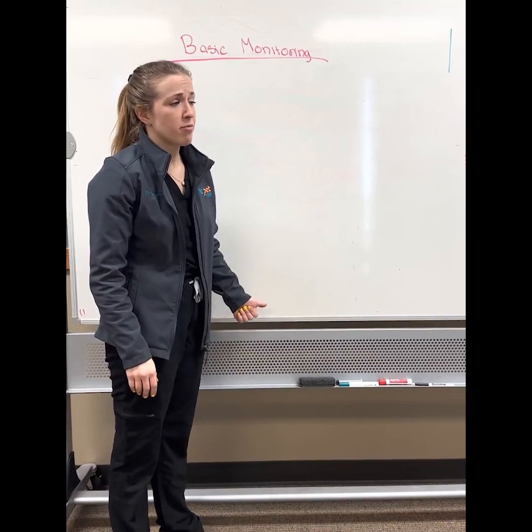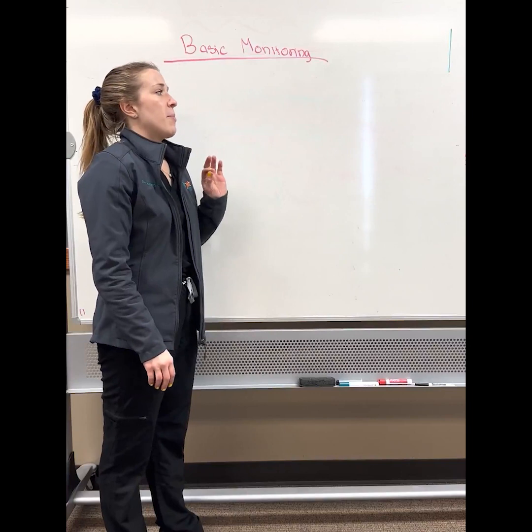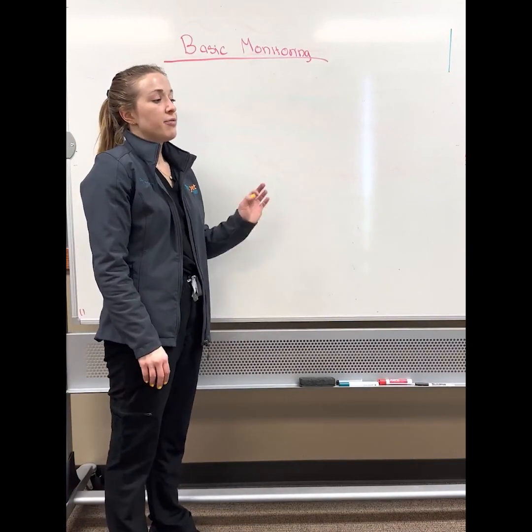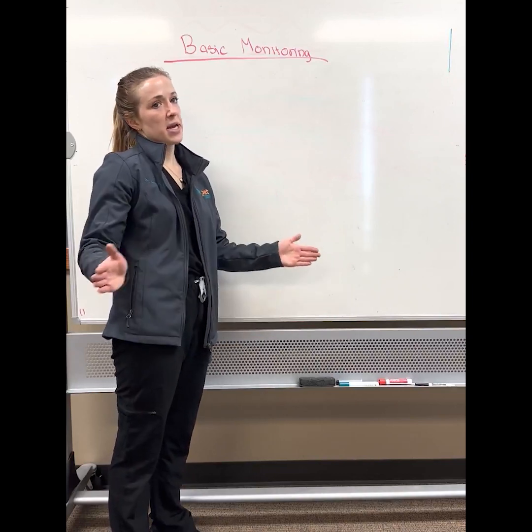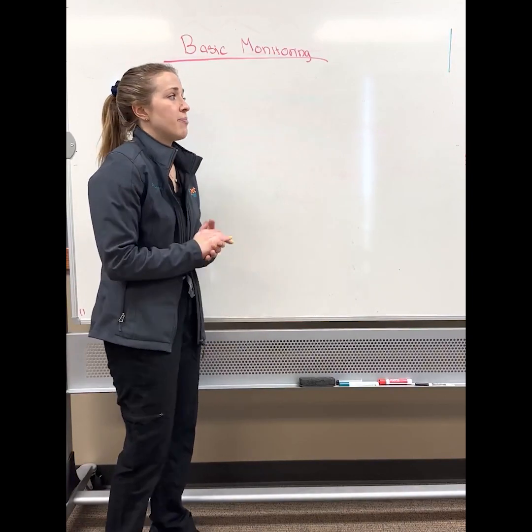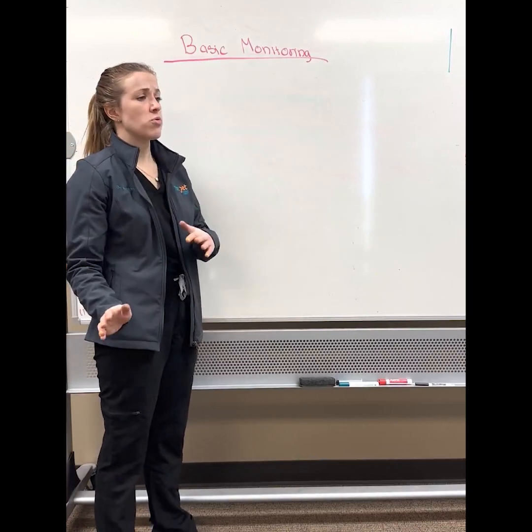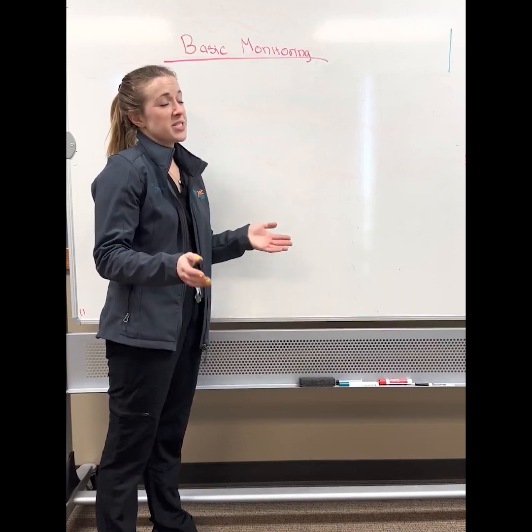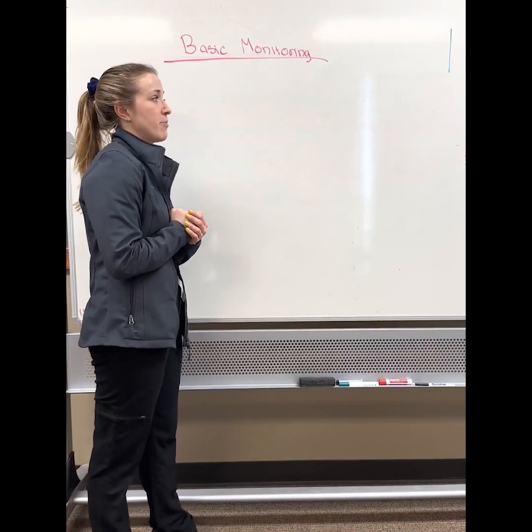Prolonged anesthetic recovery is the principal one. Hypothermia is the number one cause of prolonged anesthetic recovery. And of the animals that die in the peri-anesthetic period, 61% are going to die in recovery. And things like low blood pressure, low temperature are reasons why animals can die. And that's one of the reasons why it's really important to monitor recovery, okay?